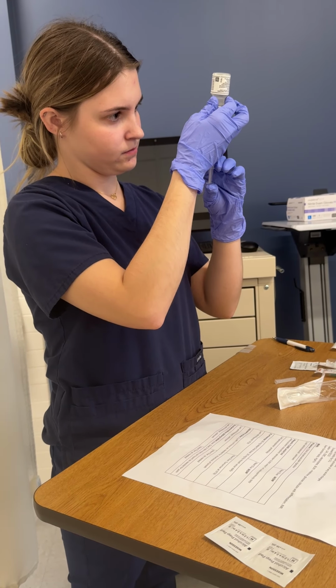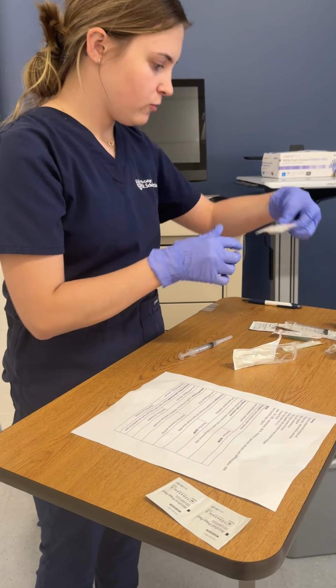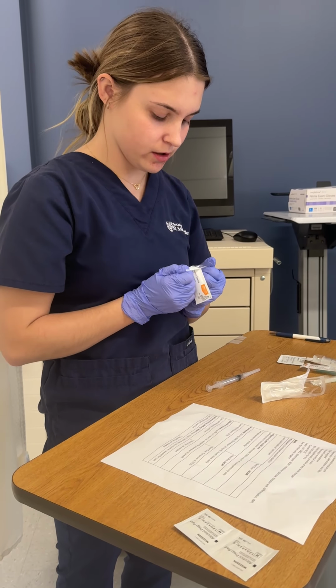We're gonna make sure there's no air bubbles, and then we're going to recap, and that is 0.5 milliliters. And then we are going to take a 25 gauge by 1 inch needle for the intramuscular one.